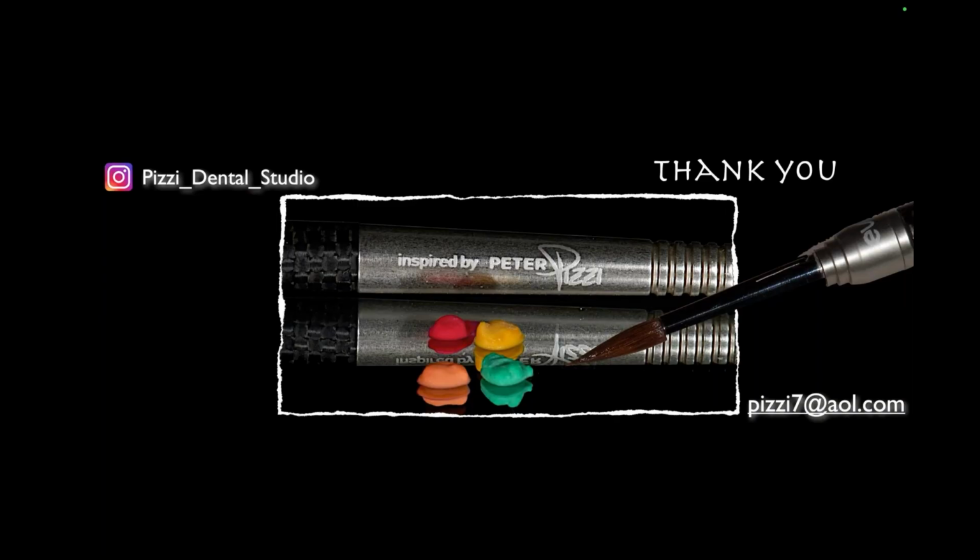All right, and then if I make a sample of tabs from my porcelain, what thickness should they be? I used to make tabs all the time. Usually we made them between 5/10 and up to a millimeter, depending on what material it was. So the right answer is if you're in dentin, it should be between 8/10 to a millimeter. If you're in enamels, it should be 3/10 to 5/10, because those are the way you really use those materials.